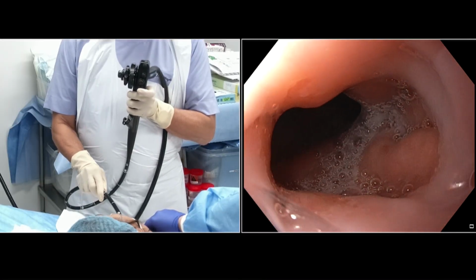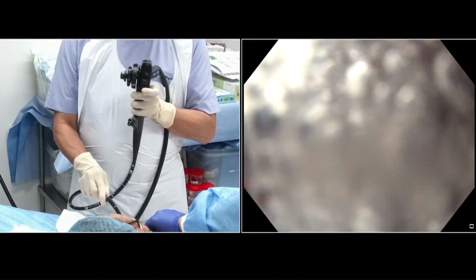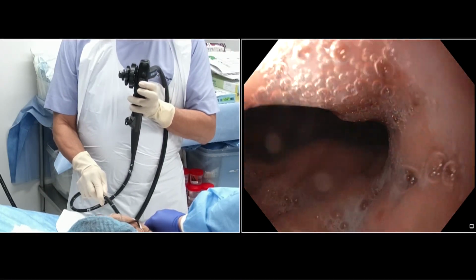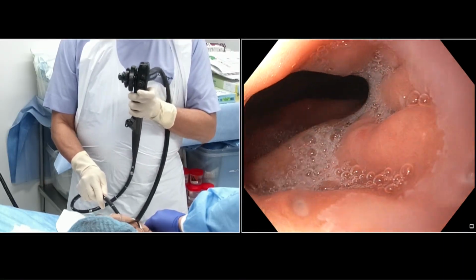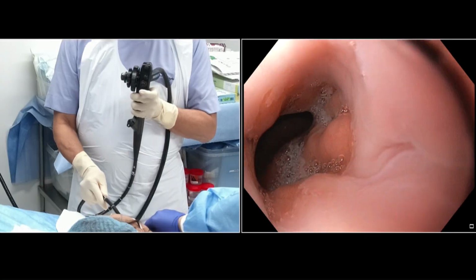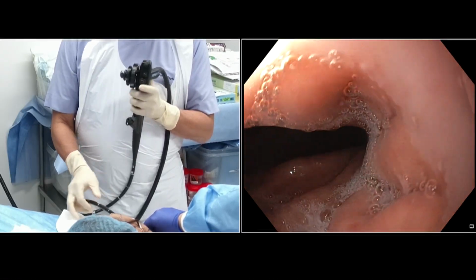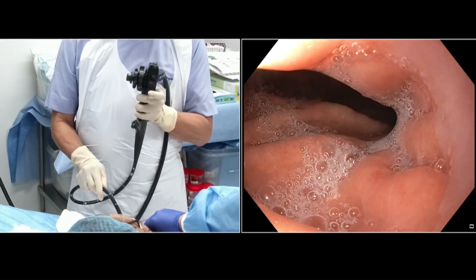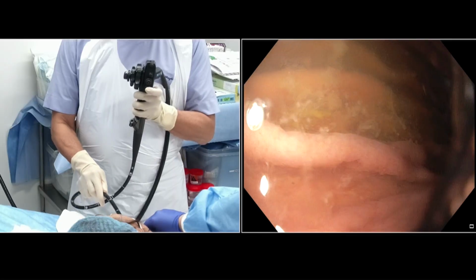It is also called the Z line. Whereas almost at the same level you can see the diaphragmatic pinch. So that means this patient does not have a hiatus hernia. If you find that the Z line is above and the diaphragmatic pinch is below with at least a 2 centimeter gap, that is an indication that there is a hiatus hernia. Now after going in the stomach, if you turn the shaft of the scope to the left, you go towards the fundus.